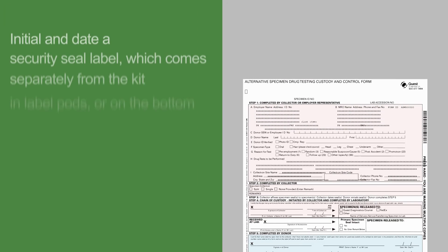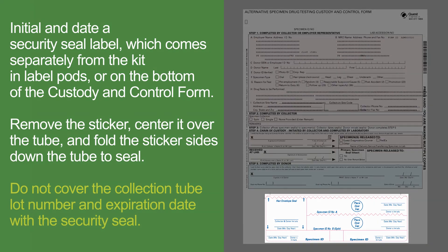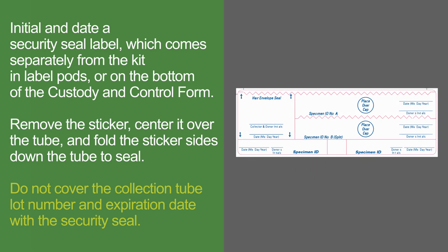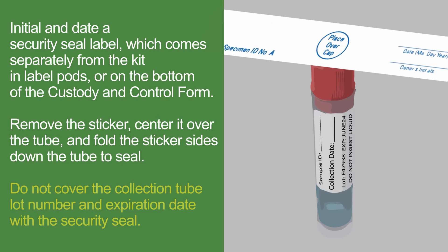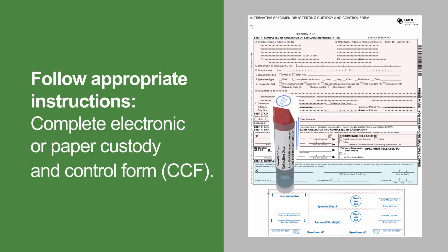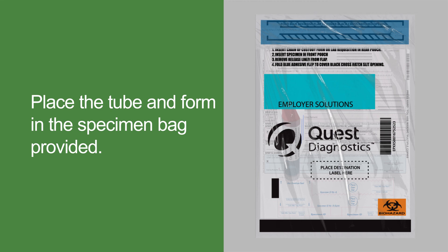Initial and date a security seal sticker, which comes separately from the kit in label pods or on the bottom of the custody and control form. Remove the sticker, center it over the tube, and fold the sticker sides down the tube to seal. Do not cover the collection tube lot number and expiration date with the security seal. Ensure that all required signatures on the form and on the specimen seal sticker are complete.